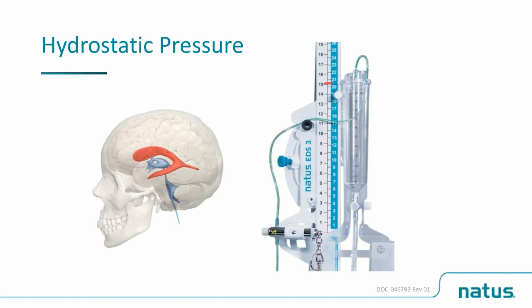CSF drainage happens because of hydrostatic pressure. Don't worry, we won't get too deep into physics. Hydrostatic pressure refers to the pressure exerted by a fluid at rest, at any set point within the fluid, due to the force of the fluid above it. We align the foramen of Monroe to the 0 point on the scale to make sure the fluid in the drain is in equilibrium before we can begin regulating it.